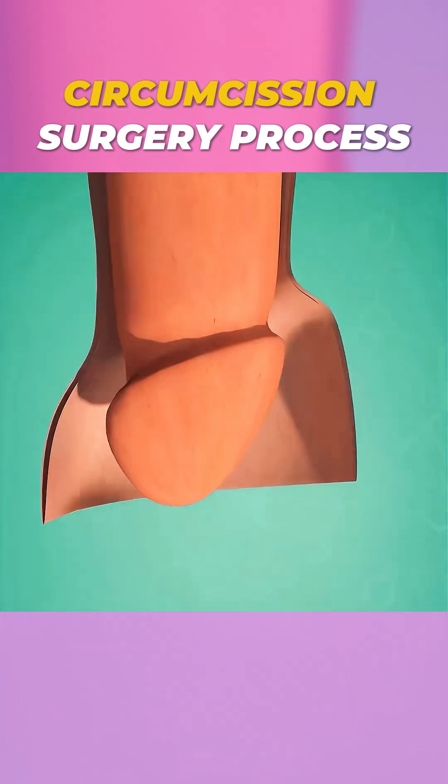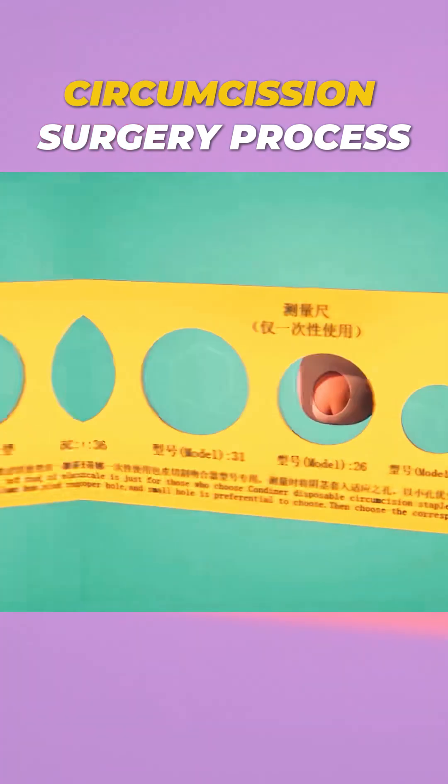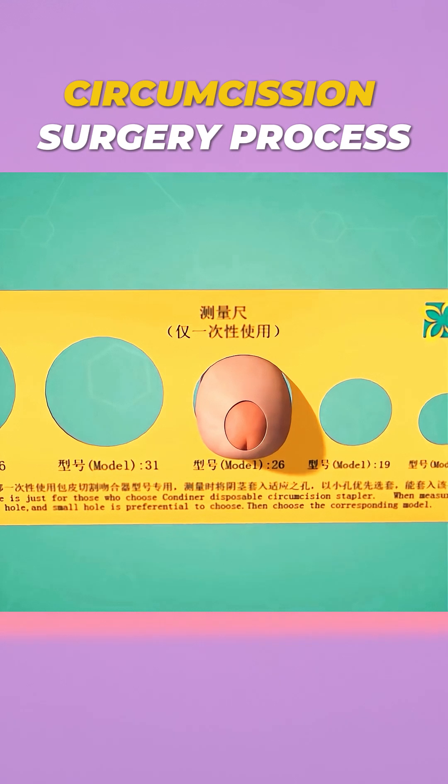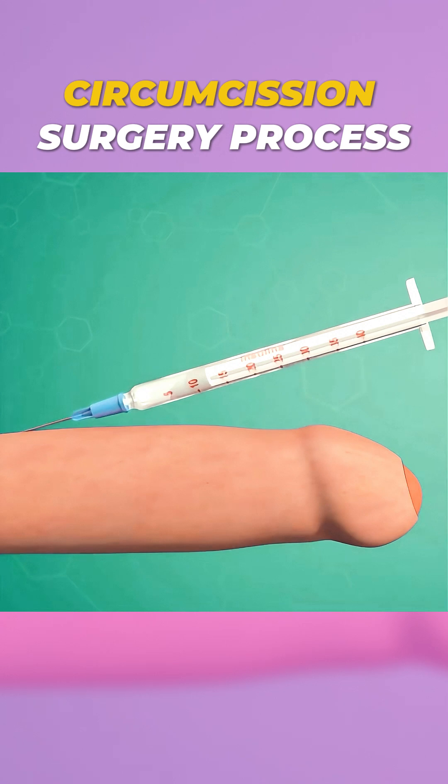Ever wondered how a disposable circumcision stapler works? Let me explain in just 60 seconds. First, a measuring ruler is used to select the correct stapler size. After routine disinfection, the patient is given local or sacral anesthesia for comfort.